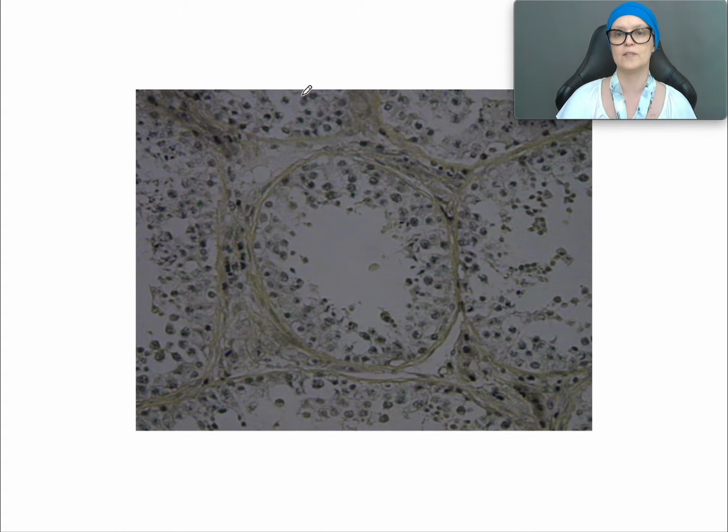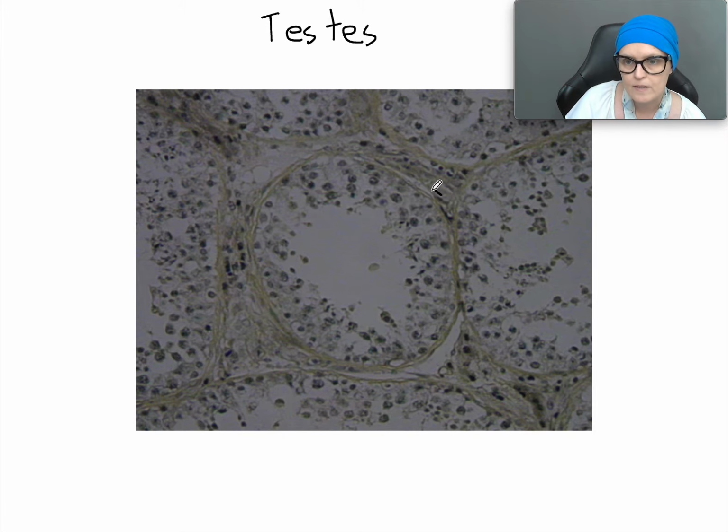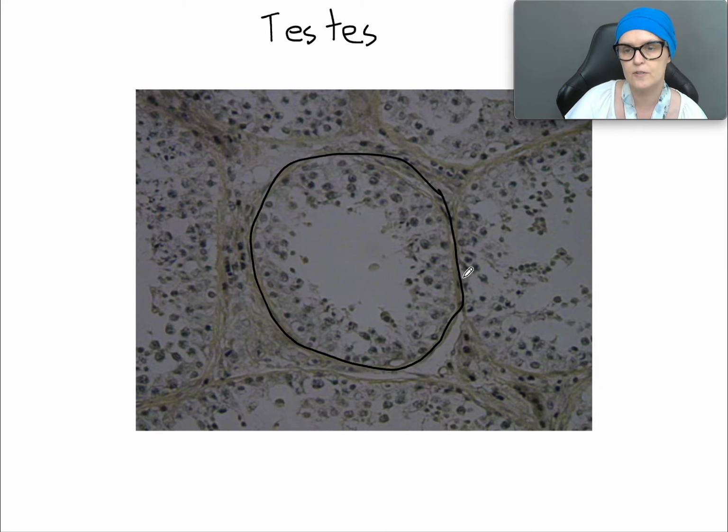And we will go over this again for lab 4, but let's get just a few basic concepts down. First of all, what organ is this? This is the testis. And we need to learn the name of these round structures. These are tubes that fold back and forth. So the whole round structure, and this is a long word for this space I have, this is the seminiferous tubule.